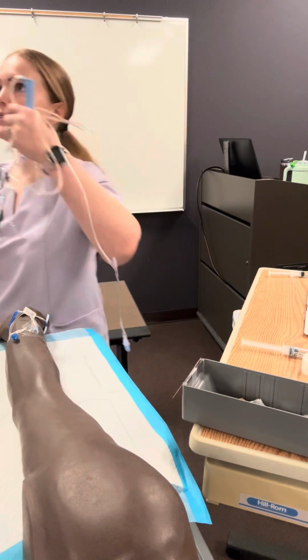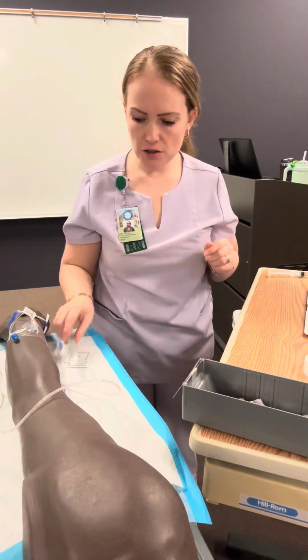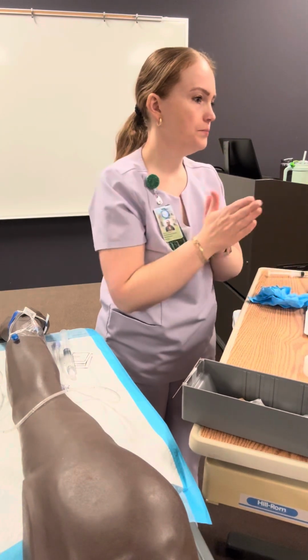So I'm going to hang this. Let me get my alcohol wipes. Let me get my flush. Put on gloves. Make sure I have hand hygiene.